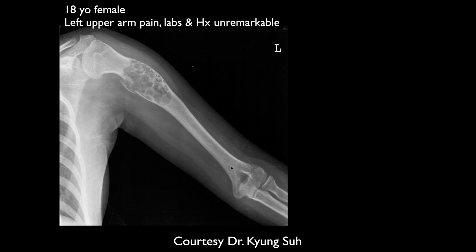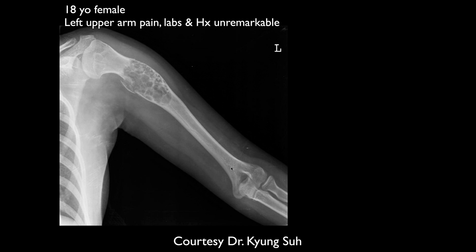John, that's not awfully common, is it? No, this isn't one of the more common osteogenic sarcomas. That's correct. So, 18-year-old female, left upper arm pain. Labs and history unremarkable. She's got this expansile lytic lesion with a bunch of areas of lucency and scalloping with a pathologic fracture in the proximal humeral diaphysis.